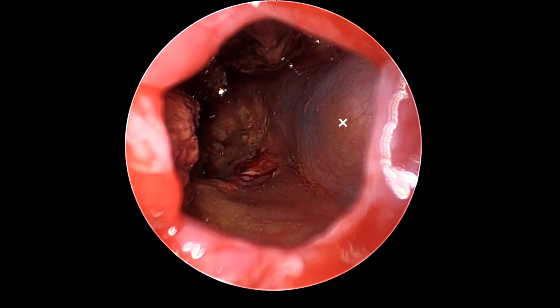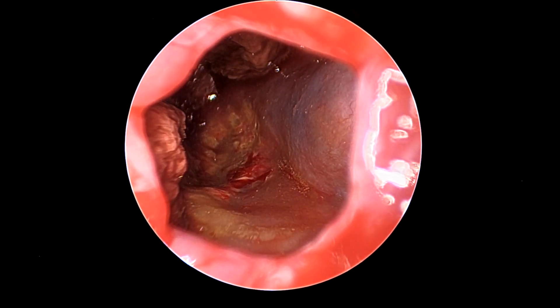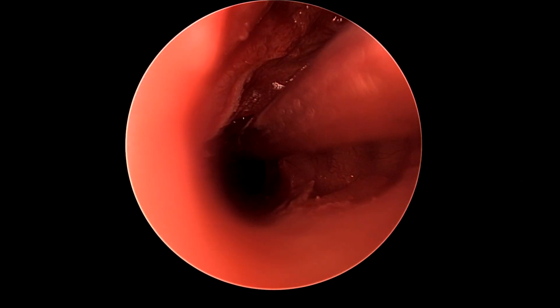Putting the endoscope in we can see the dura over the brain stem within the cholesterol granuloma, and then the remaining granuloma remnants are attempted to be removed by irrigation with copious body temperature irrigation to clear the cyst out.